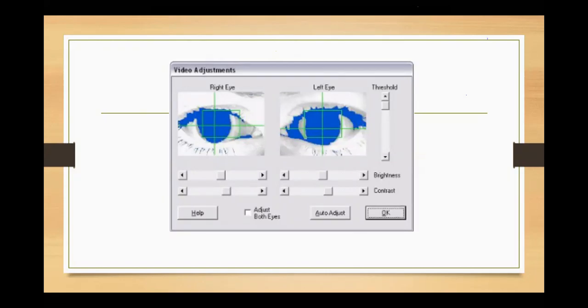It is made for adults. So if you are going to test a very small child, the goggles will not fit his face. Even if you adjust the bands, which make it fit on the head, still if it is not fixing properly, if the goggles are moving, then you will have a problem.